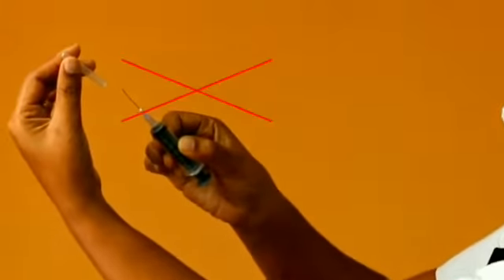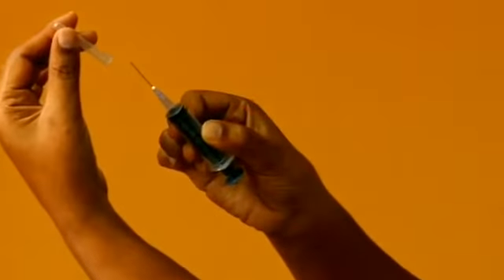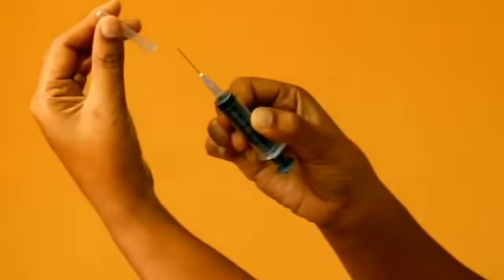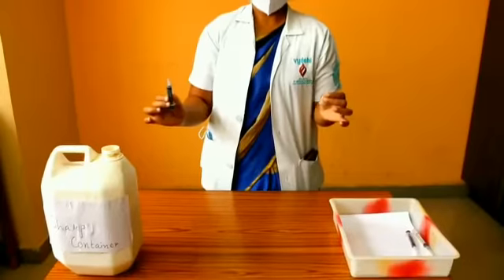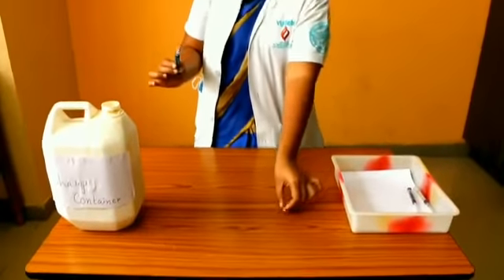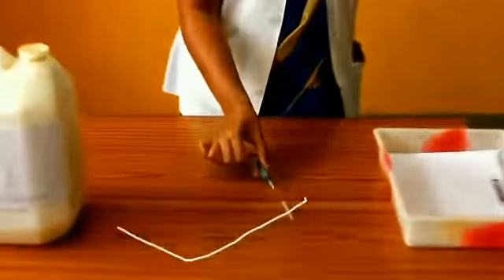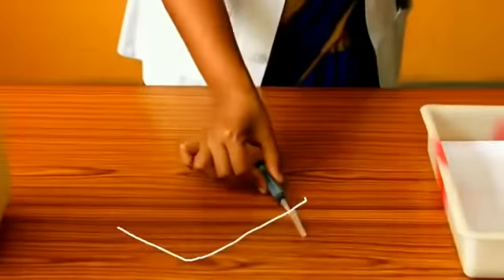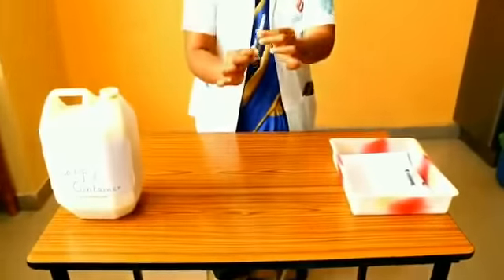For sharp safety, do not recap a used needle. We will now demonstrate the one-scoop technique to safely discard a used needle into the puncture-proof container.